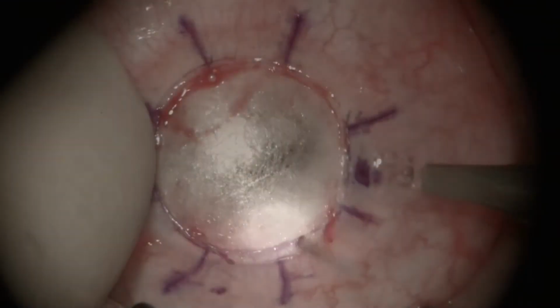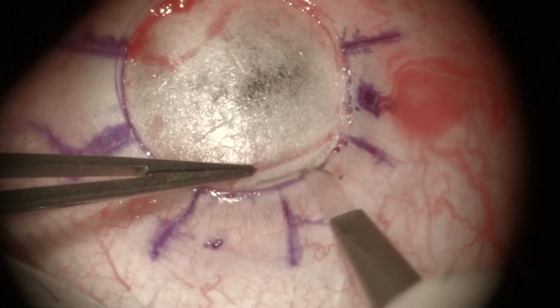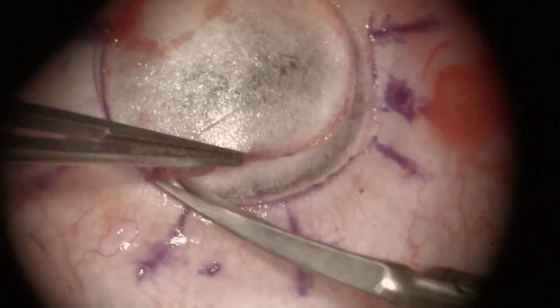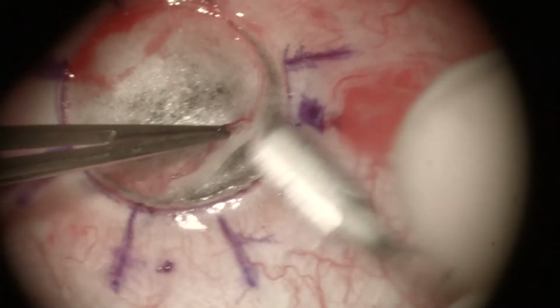How do we reach the correct plane? Without the aid of the big bubble, we have to decide what plane to dissect. We first perform a vertical incision in search of a dark line or zone representing a very thin layer above the Descemet layer. The thinner the remaining layer, the better visual acuity post-op.